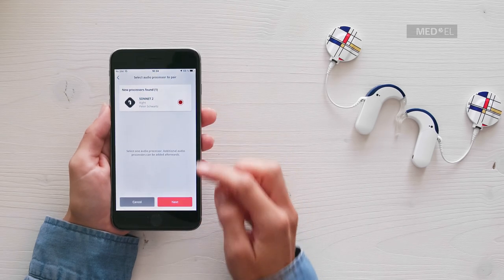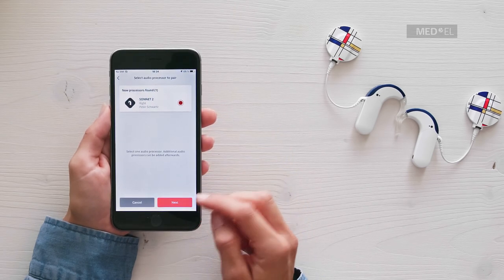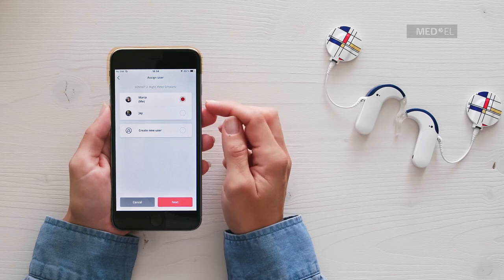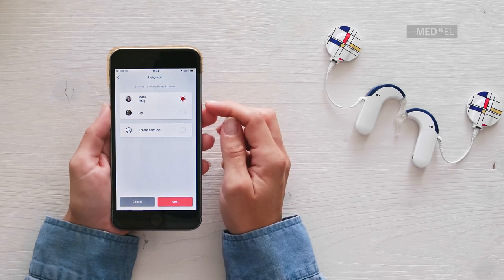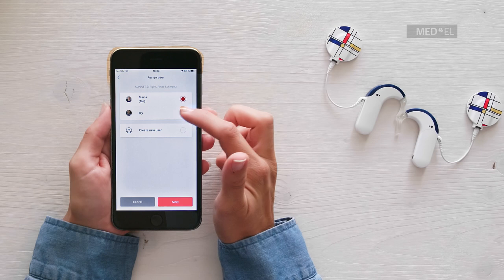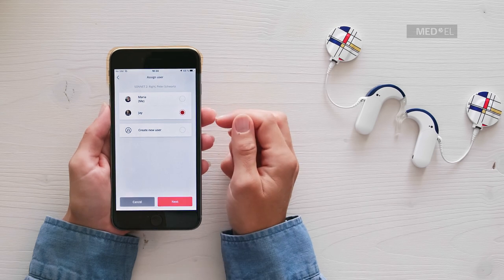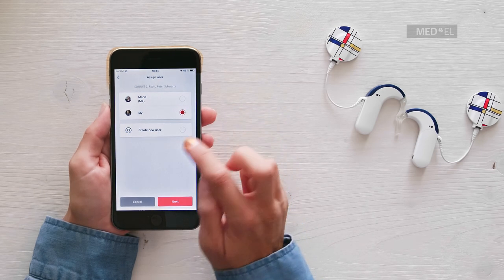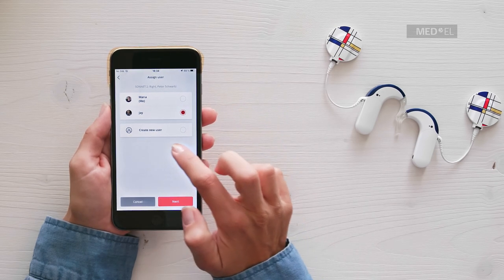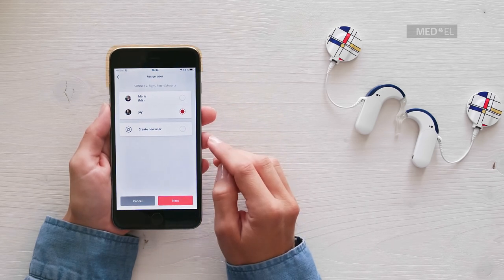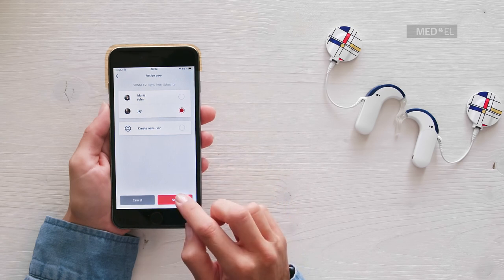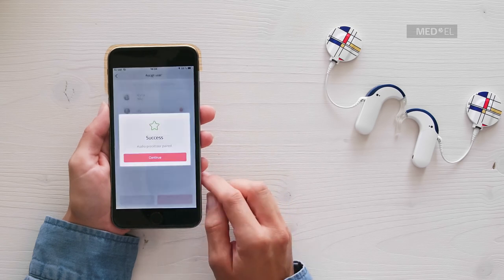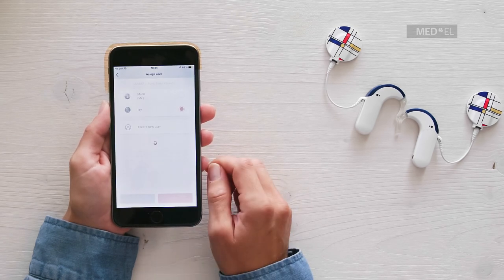Tap Next. To assign the audio processor to your child or someone you look after, select their name from the list. If their name is not there yet, tap Create User. Enter their name and tap Create. The audio processor will now be assigned to this person.